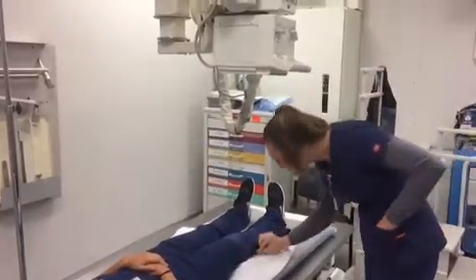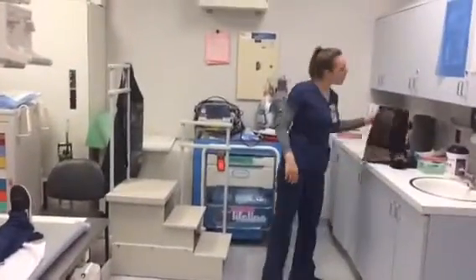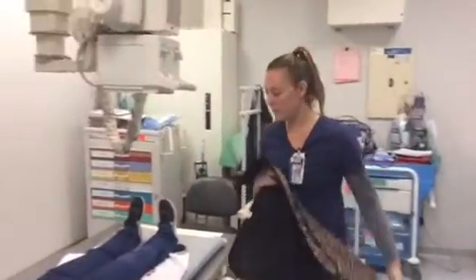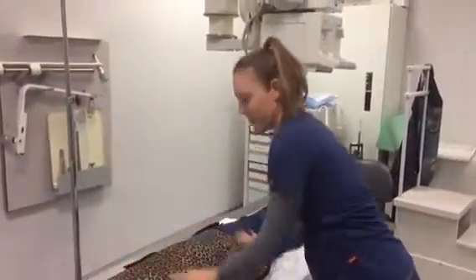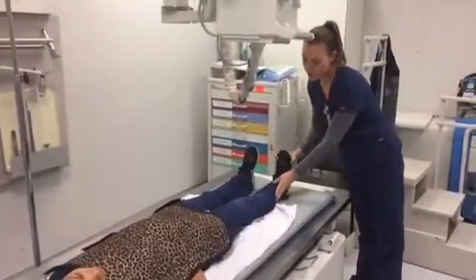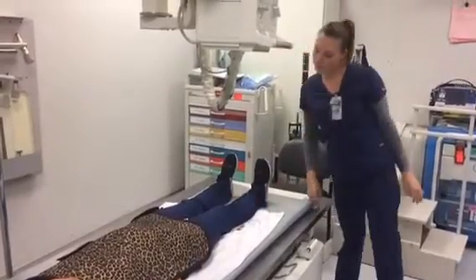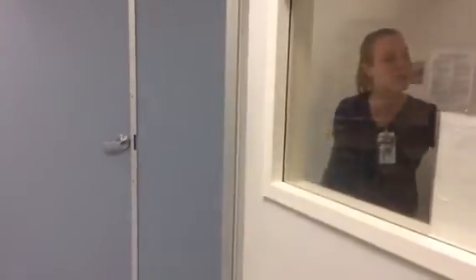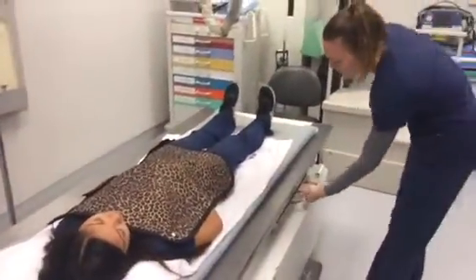I will be marking my image. And then we will also be shielding our patient. Make sure everything looks good. Okay, so this is the AP projection. Okay, don't move. X-ray. Okay, so now we're going to do the next projection.